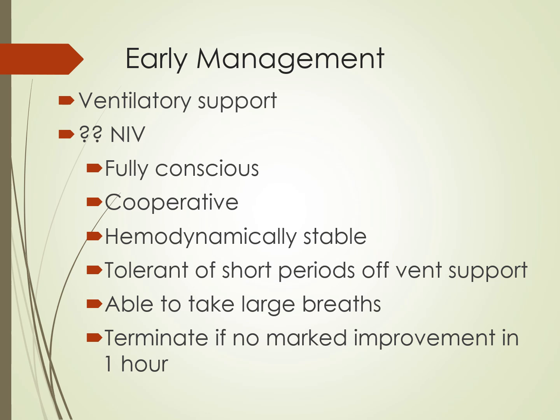Some of the criteria are that the patient has to be fully conscious, they have to be cooperative, they have to be hemodynamically stable, they have to be able to come off the mask and possibly eat and drink some fluids. They have to be able to take some decent tidal volume, some decent breaths.